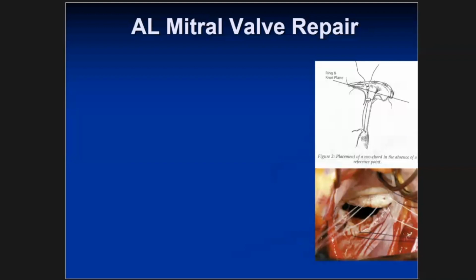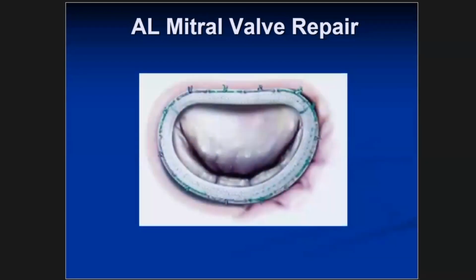And the complicated area that had to be solved is the length of the cord. And not only that, but the length of the cord when the ventricle is full, because when we're assessing them intraoperatively, we have a still heart that is empty. So again, we're trying to attach the cord to the coaptation line to create that physiological consequence and closure mechanisms. And of course, always we add an annuloplasty ring, and I will talk about the importance for that in a moment.